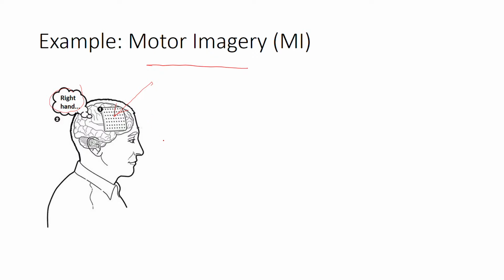As I told you before, in our case, we're going to use the Emotiv headset for the same purpose. Once you have placed the electrodes on the scalp, then you're going to acquire the EEG signals. And then we need to interface and manipulate the signal in a digital domain.